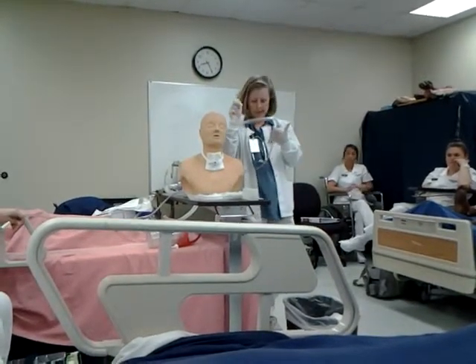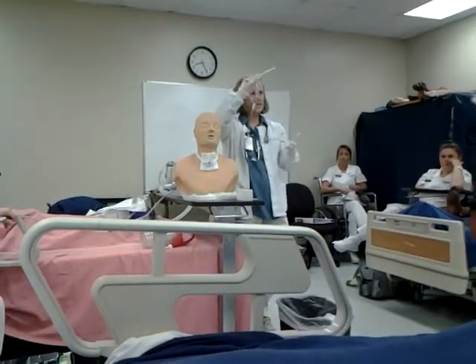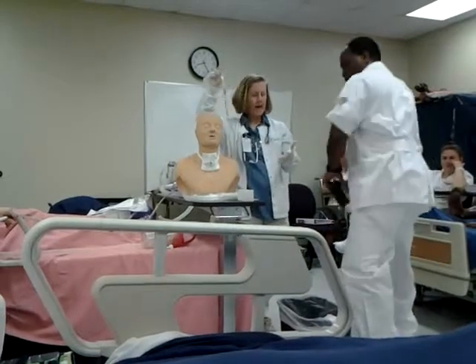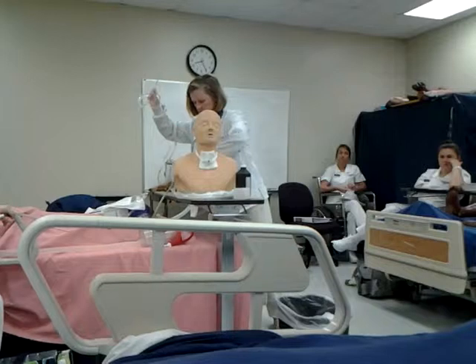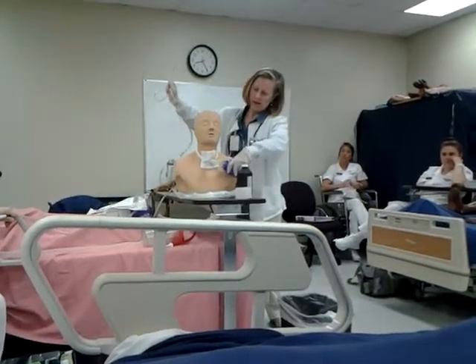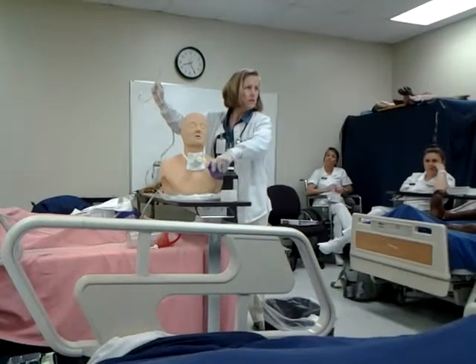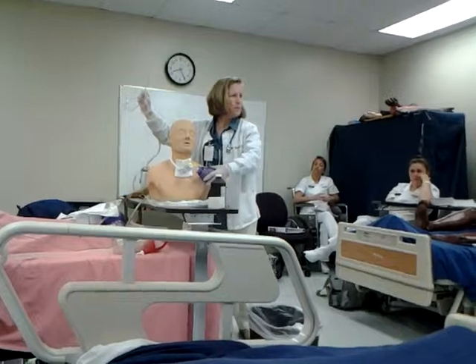Once I finish, this hand is contaminated. This hand is sterile. I can now take my AMBU bag. Thank you, Jeff. You're welcome. And I can ventilate my patient. And usually when you ventilate your patient, breathe with it.